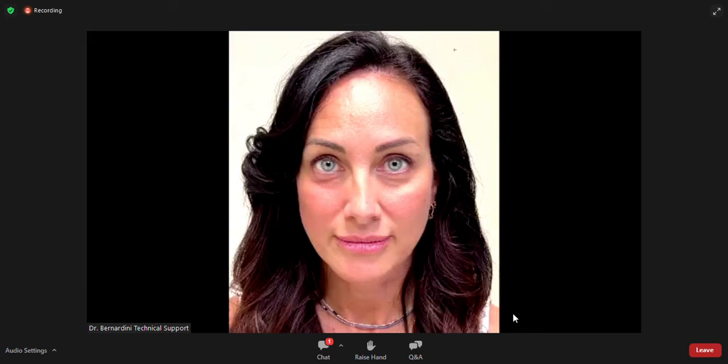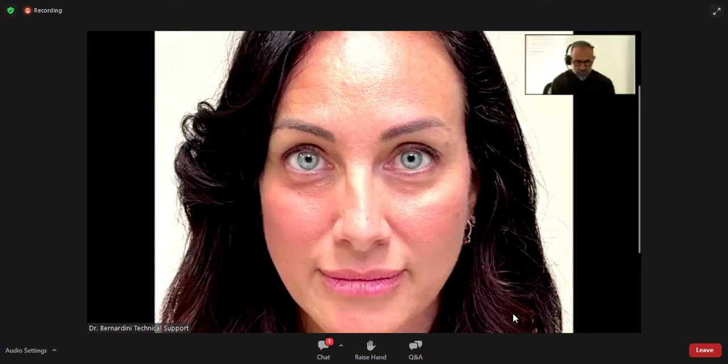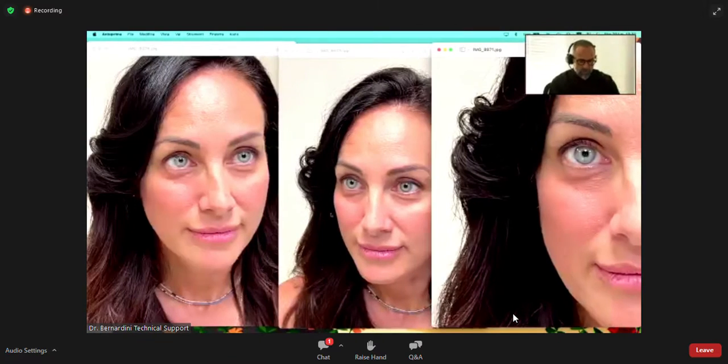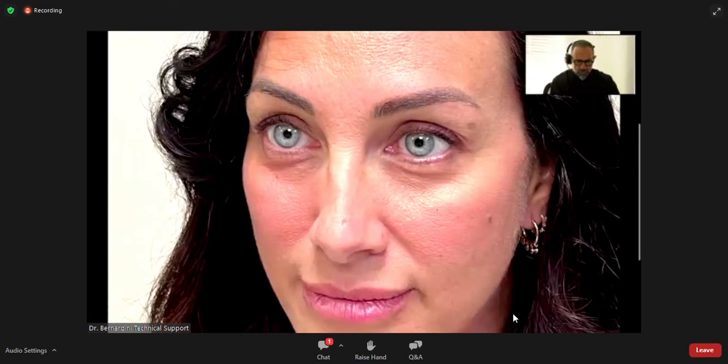Okay. As you see here with better lighting, because with the camera and the pictures it's better, the pictures are always better. I was pointing out that she has very high, strong cheekbones. It's much less like the Asian, but yet she does have a full infraorbital hollow that highlights some aging or tiredness to the eyes. And if you look at the side view, that will become even more apparent, that you need to restore, to reconnect the cheek to the descent of the ligament here.